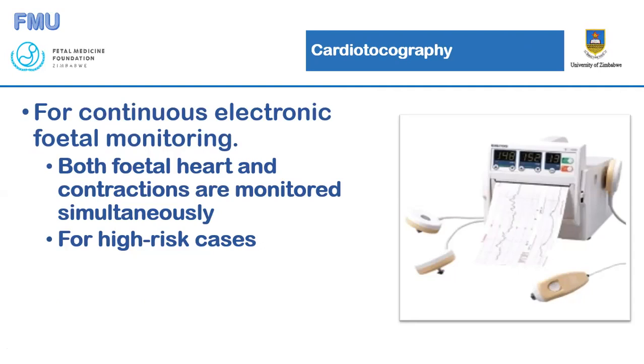So the role of the CTG is to monitor high-risk pregnancies. Why are we doing fetal monitoring? Why are people doing Dopplers? Why are people making all this effort to monitor babies? The whole role is to predict fetal hypoxia, to pick up fetuses which are at risk of hypoxia. We should never lose this fact, because hypoxia is what causes brain damage, which causes us to produce babies who will perform poorly in society.